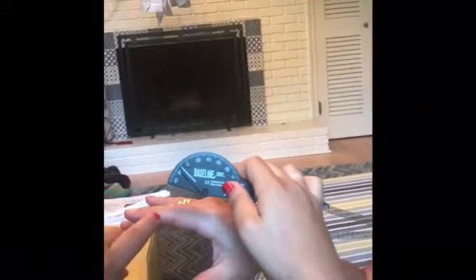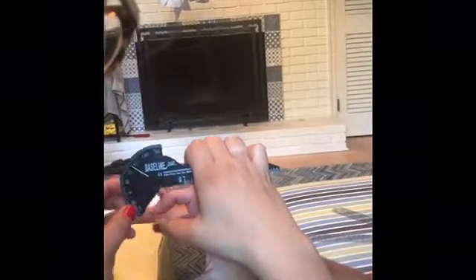And lastly, we have the flexion of the finger DIP joint. So typical range of motion is going to be 0 to 70 degrees. The axis is going to be the dorsal surface of the DIP joint of the finger tested. Stable arm is dorsal and midline of the middle phalanx of finger tested. The moving arm is dorsal and midline of the distal phalanx of the finger tested. So you're going to go ahead and put your... it's at 60. Okay, cut.